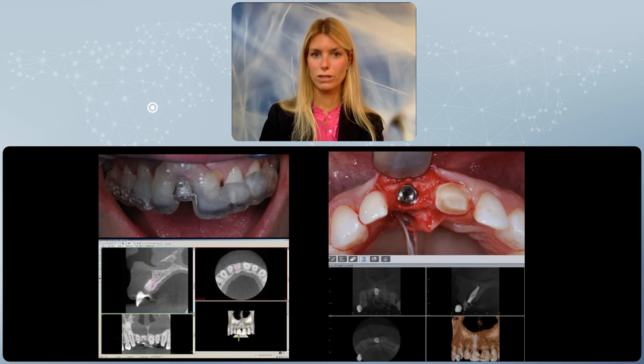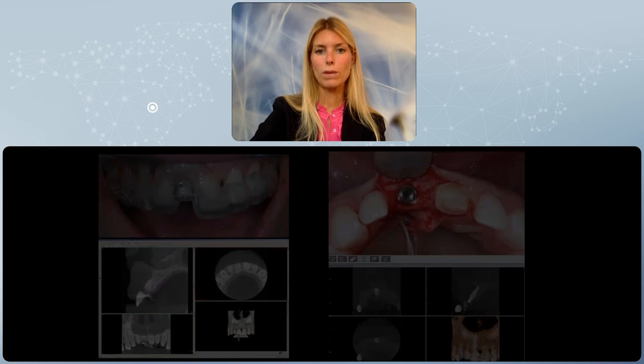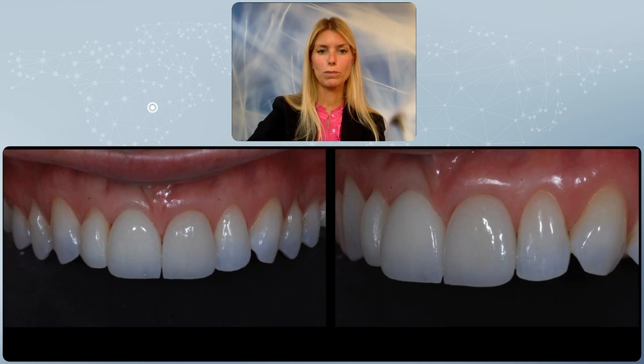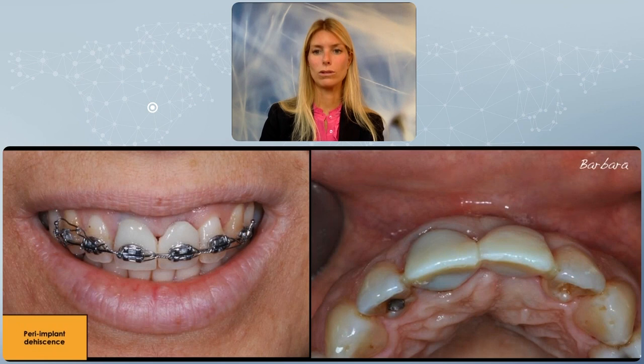on the final outcome. So when the implant is positioned in the right 3D position, it is fully embedded in bone, so that's not an issue. However, because we want to improve the aesthetics and we want to achieve a very natural contour and smile, we add a connective tissue graft to be able to give that extra soft tissue volume that we're looking for. So in fact, we are following the classification where there is sufficient bone volume. Now let's start looking at cases where in fact we do not have the ideal situation.